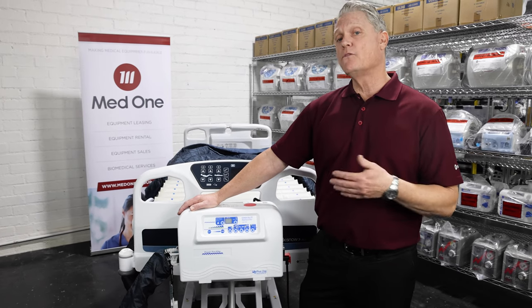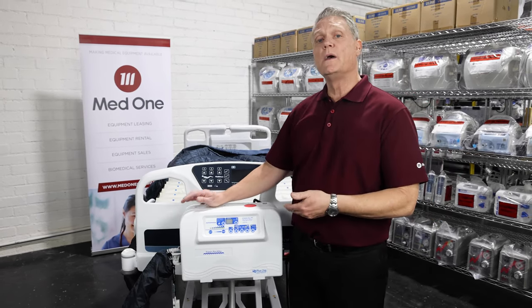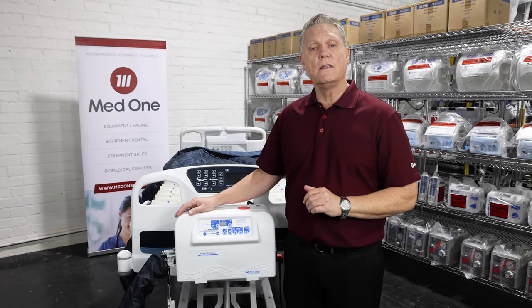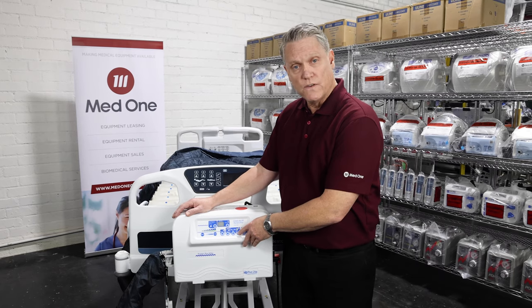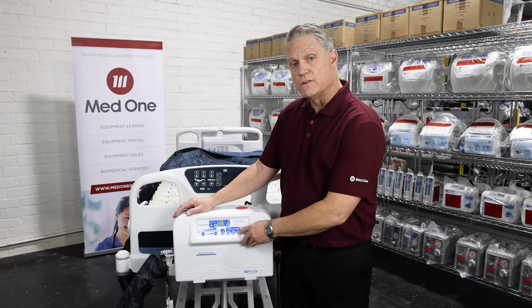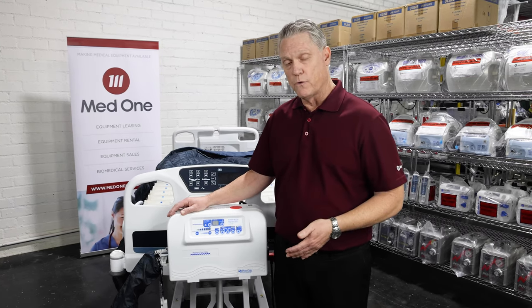It is easier to move a patient on a firm surface than it is a soft surface. When you go to reposition your patient, allow 10 to 15 seconds, reposition your patient and then ideally you want to turn this feature off. If you forget, there is a 20 minute fail safe where it will automatically turn itself off if you do not remember to turn it off for your patient.